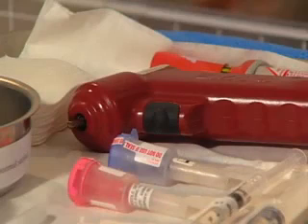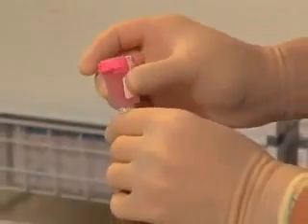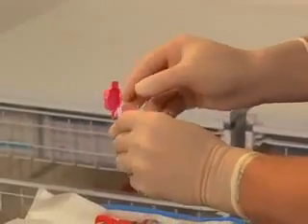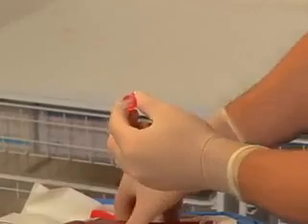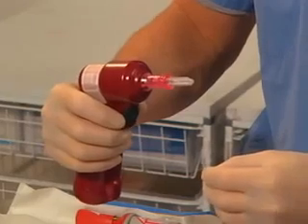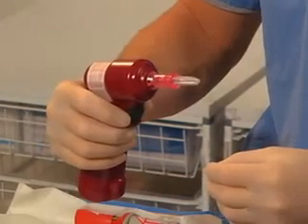Select the appropriate needle size based on the patient's weight. The pediatric needle is designed for use in children weighing less than 40 kilograms, unless large amounts of overlying soft tissue predict the need for a longer needle. Remove the needle from its protective container. Attach the needle set to the driver, allowing the magnetic pull to hold it in place.